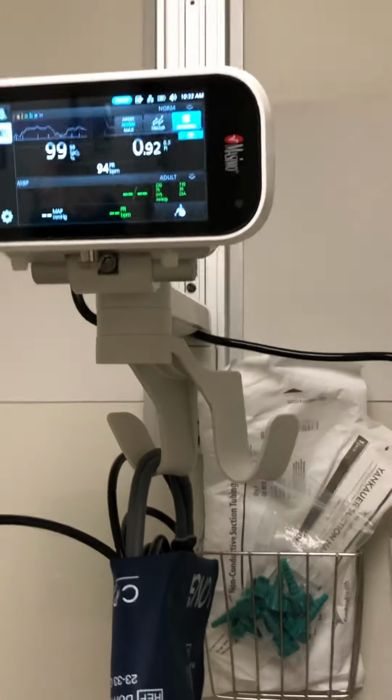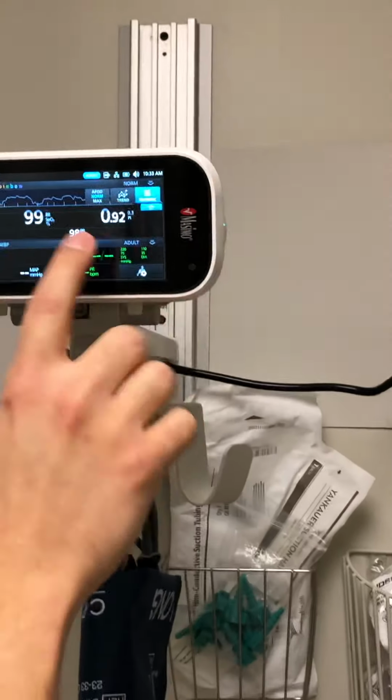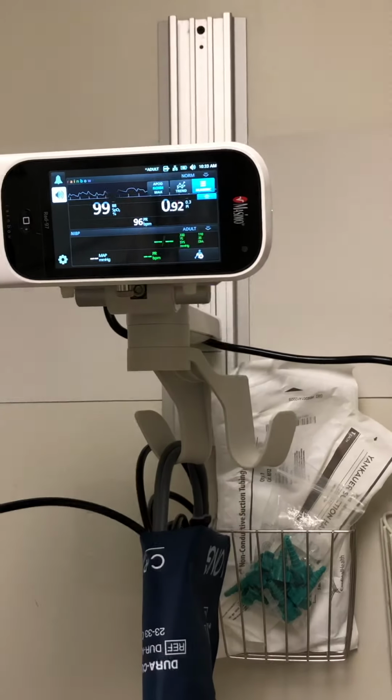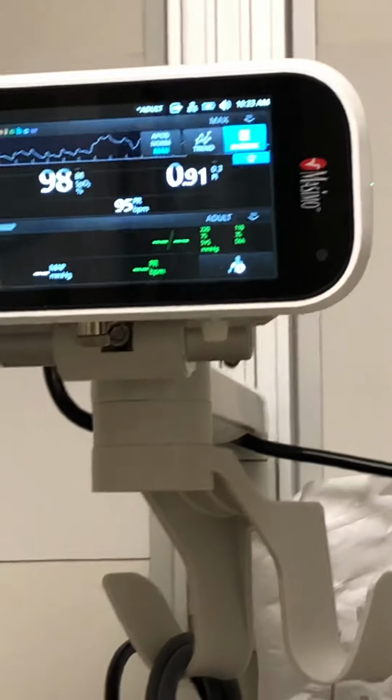That better? Yeah. Okay. So, like I said, on a challenging patient like myself, what you can do, whatever's highlighted in blue is the current setting you're in. So if I wanted to, I can make our device or switch it to what we call max sensitivity.